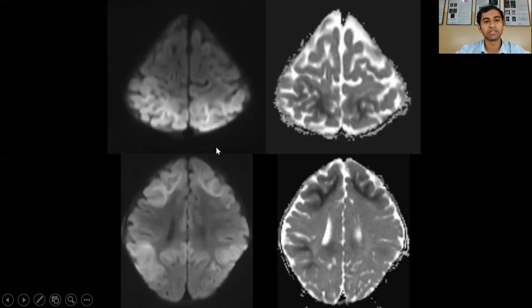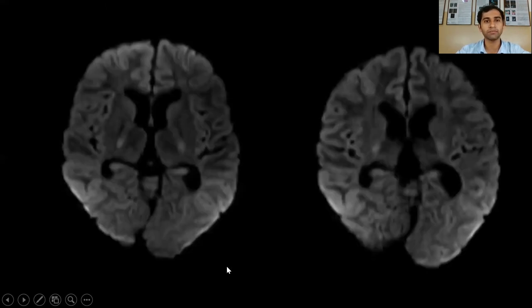This is another case of a 10-year-old patient with a history of repeated seizures. You can see areas of restricted diffusion in the bilateral frontal and parietal lobes, which are symmetrical in distribution.